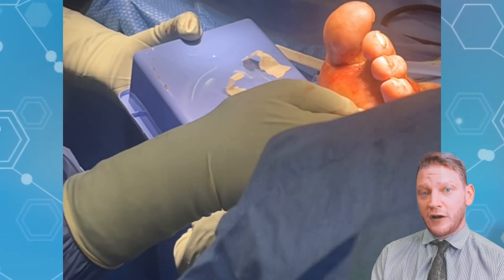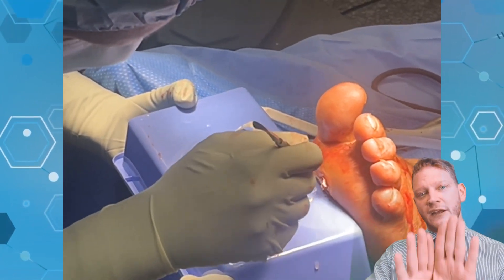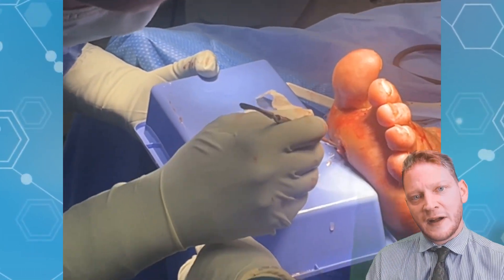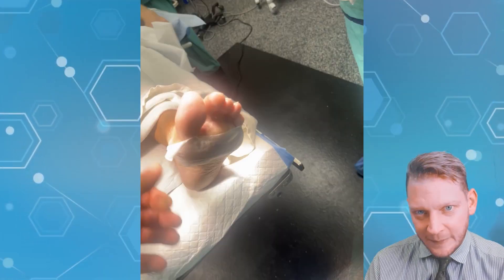So here's the graft. First we cut some tiny pieces up, put them into the wound, and then apply it on top and staple that down. We put a piece of Adaptic on top — Adaptic is like a petroleum-laced gauze — and then we wrap it up. Overall it was about 10 to 15 minutes and this guy's going to heal great.